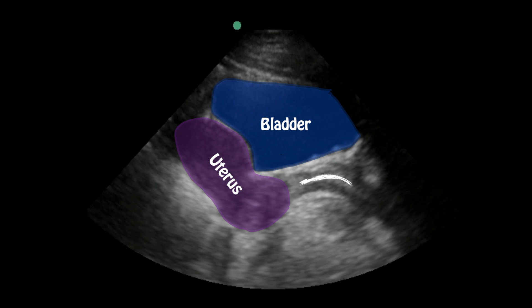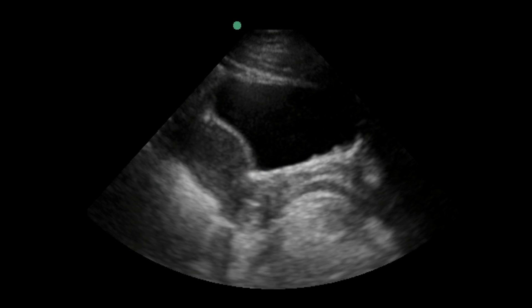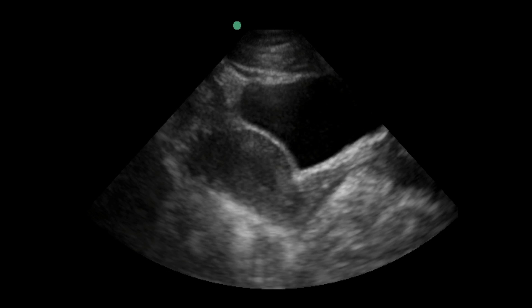I'm going to walk you through this and show you the important anatomy. We want to angle our probe up so that we see the uterus and fan through it to see if anything is visible within it. We also want to pay attention to the surrounding anatomy. What we see here is that the uterus is empty — there's essentially nothing in it. Typically by finding an intrauterine pregnancy we can rule out an ectopic, but in this case the uterus appears empty.